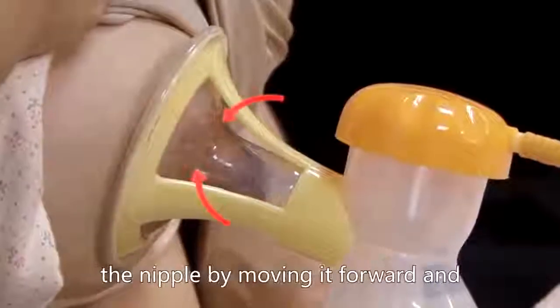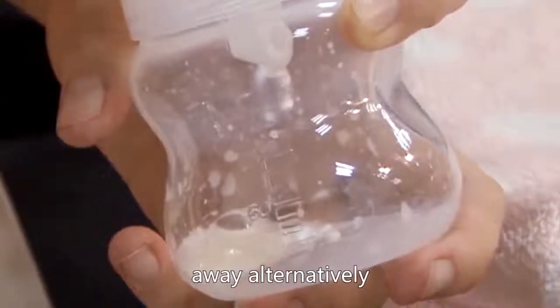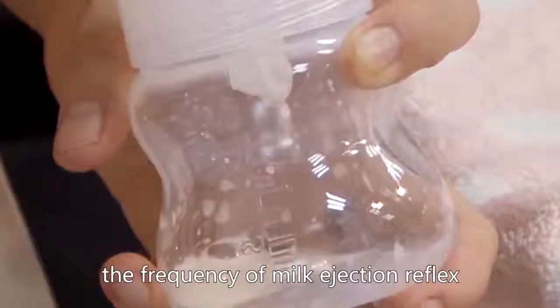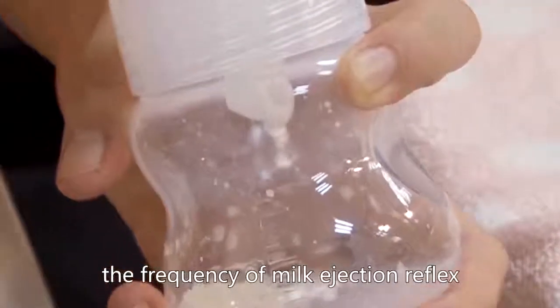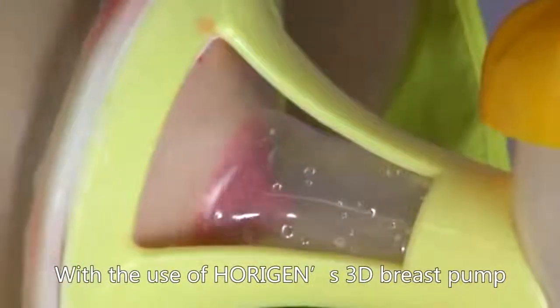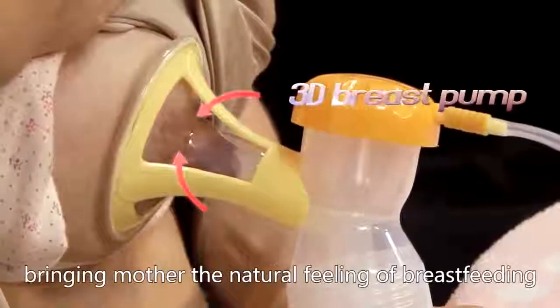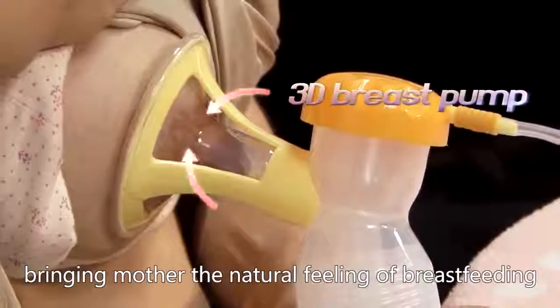The tunnel of the breast shield stimulates the nipple by moving it forward and away alternatively, which can increase the frequency of milk ejection reflex. With the use of Horigen's 3D Breast Pump, it can mimic the sucking action of a baby, bringing the mother the natural feeling of breastfeeding.